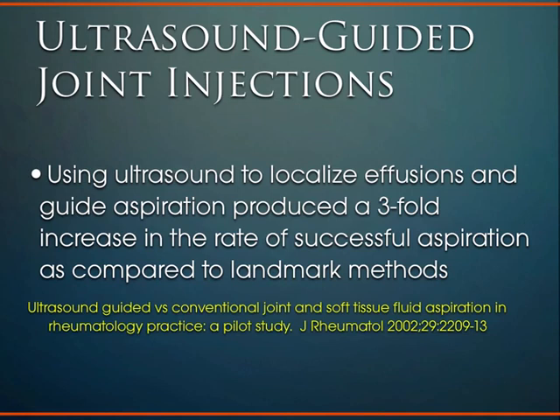You're not using fluoroscopy, which is a typical modality that guides injection treatment, but it's radiation exposure for not only the patient but also the practitioner who's doing it all day. You can't wheel the fluoroscopy machine in and out of all the rooms, and ultrasound guidance is very nice, very dynamic, and very useful. What we'll start to see more of, and what's already in the literature, is that ultrasound guidance versus our traditional surface anatomy or blind injections is much, much more accurate.